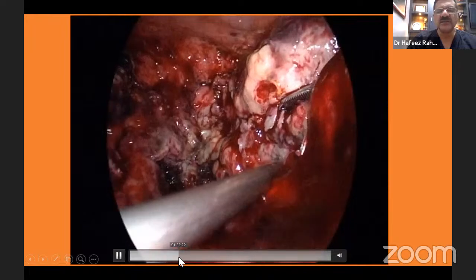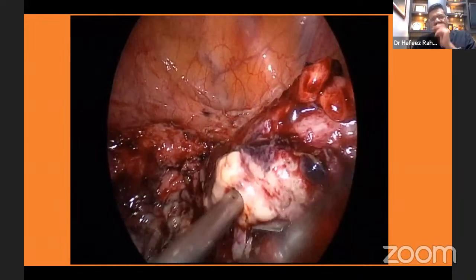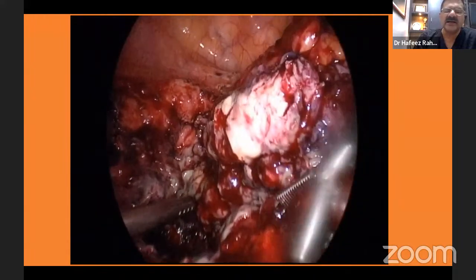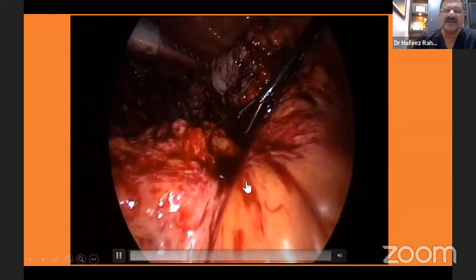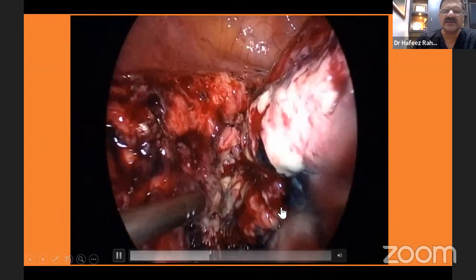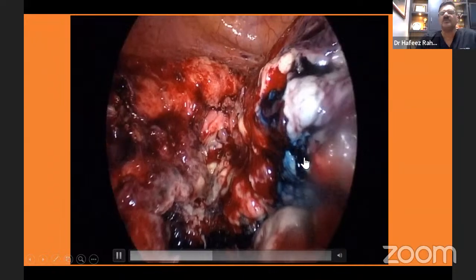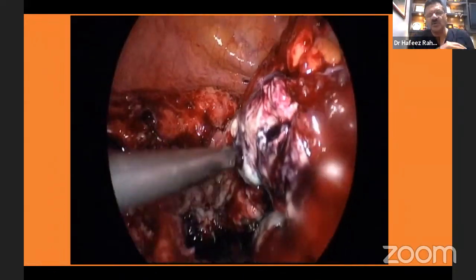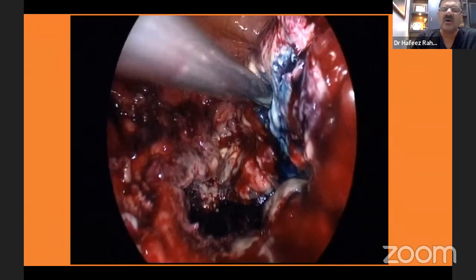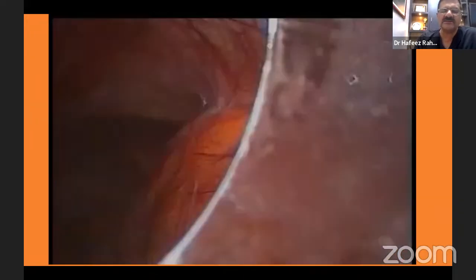As you can see here, that's clearly a fistula. It's a posterior fistula. This was a case where there was a lot of sacral endometriosis which we resected, and you can see it's fully posterior to the rectum here, and not at all anterior. So it's a little difficult to repair. You can see we are injecting the methylene blue, and you can see the methylene blue coming here. In these cases, repair it nicely and do a colostomy. It is very, very important to do a diversion colostomy or ileostomy in all cases of secondary repair of bowel. Extremely important to understand that.